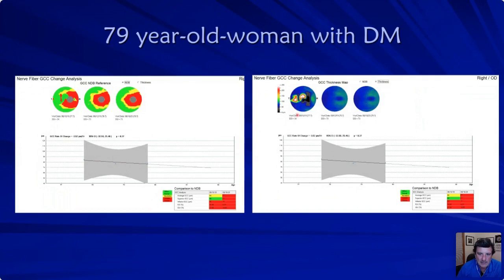And look right here, you can see the signal index was 34, and this is 73, 73, again, 34, 73, and 73. This is just a bad scan, but why I want to point that out is look where it put this dot. And if we would then get rid of this dot, look at how you would trend a little bit flatter and a little bit flatter.